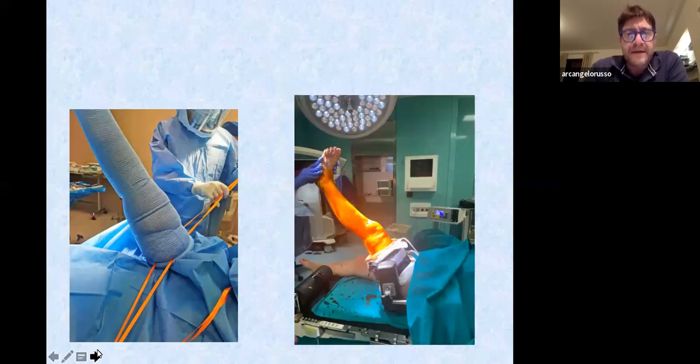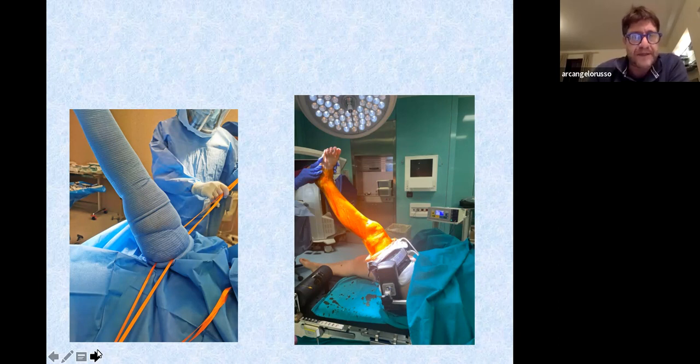In this case, you see how useful the silicone ring is. It is very close to the knee surgery field on the right with a normal tourniquet, and this is far from the knee on the left. This is important to move the knee on the right, in the better position that you like, and also for the infection, as we said before.